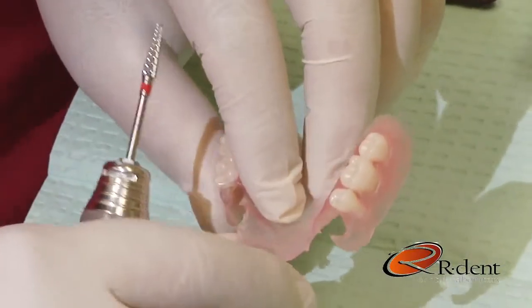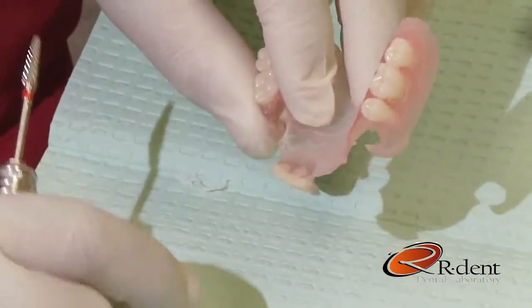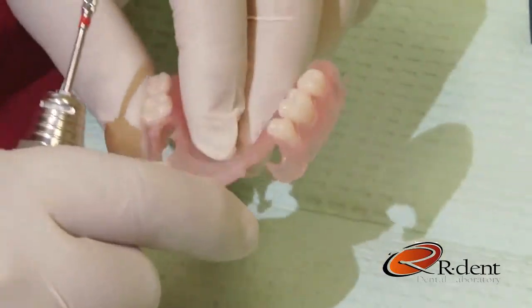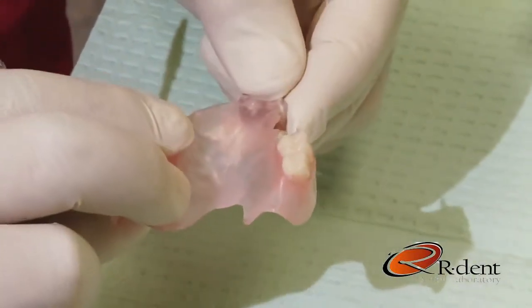One of the biggest questions that I get is, can Valplast be repaired? So what I've done is I've taken the two most popular shades, our Meharry shade and our standard shade, and repaired these two anterior teeth, so you can see that the material can be repaired.